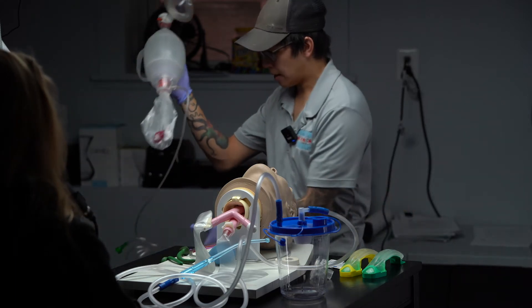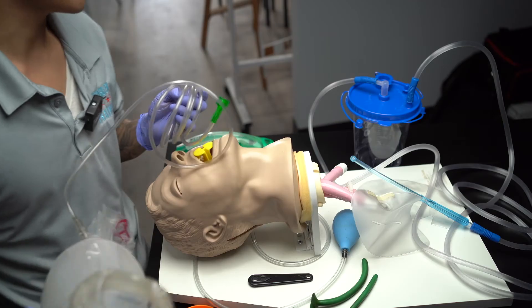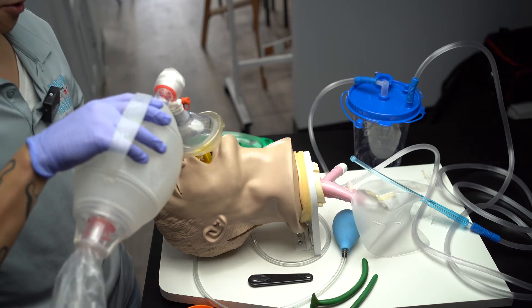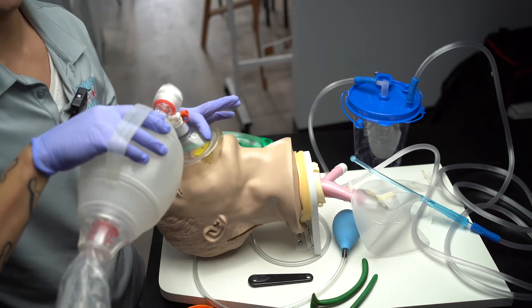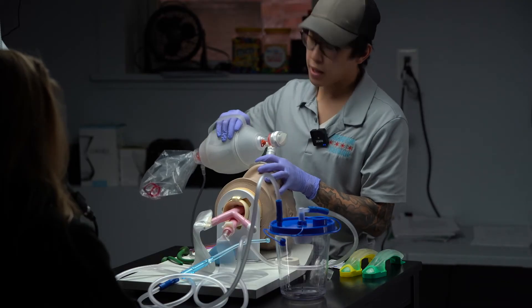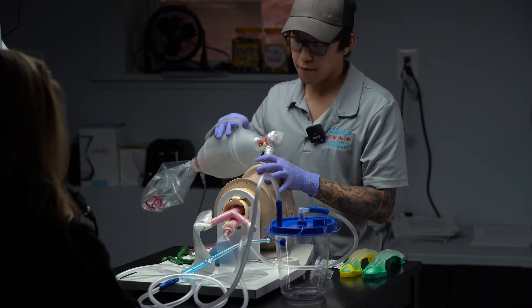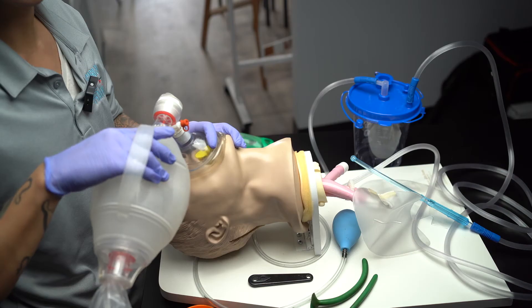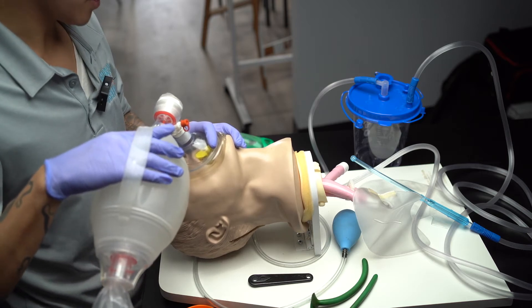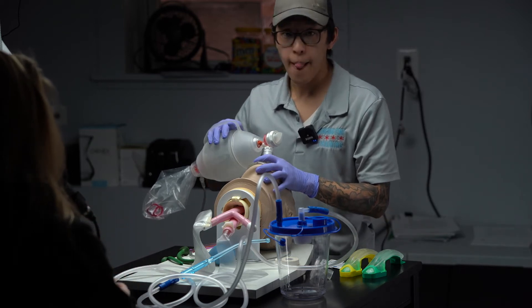I'm going to take my BVM. The BVM does have tubing, and I want to connect this tubing to 15 liters per minute of oxygen. I'm going to start ventilating utilizing a CE technique, CE grip on my mask. I'm going to ventilate over one second every five to six seconds. I'm going to apply a pulse ox on the patient's finger. The pulse ox is deteriorating and it's becoming more difficult to ventilate — it looks like it might be time for a supraglottic airway.